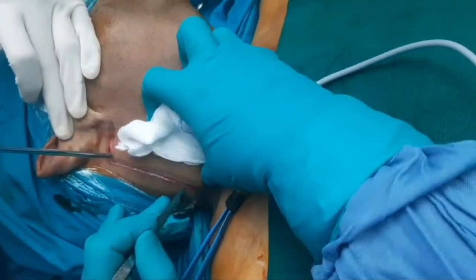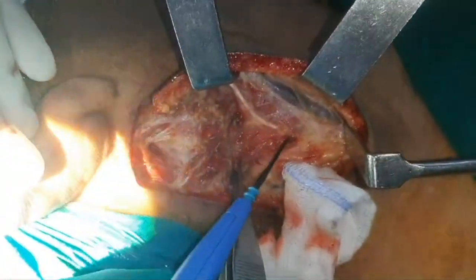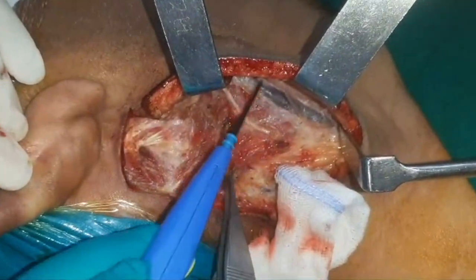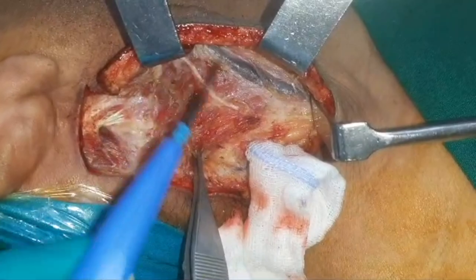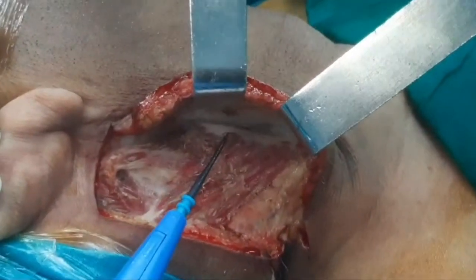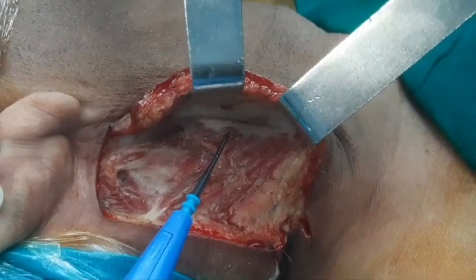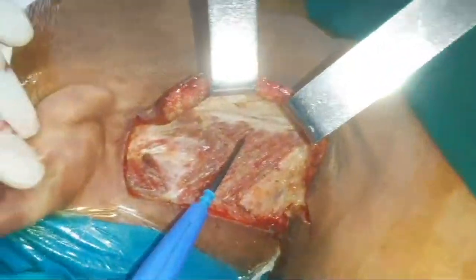Just after incision, the first structure you encounter will be sternocleidomastoid muscle. So here you can see sternocleidomastoid muscle, greater auricular nerve and external jugular vein. The next thing you need to identify is platysma. Obviously, we all can identify platysma, and in the same fashion, we need to raise this flap till we reach midline.